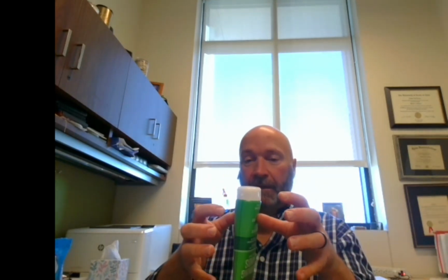Look what happens with my fingers that are furthest away from the image receptor. As I oblique up, they become projected on top of themselves more and over the spine, but the side that's closest to the image receptor, they open up, right? So they appear elongated. They're not really elongated, but they appear elongated because you're used to looking at them like this. So on your AP, your side of interest is going to be the side closest to the image receptor.